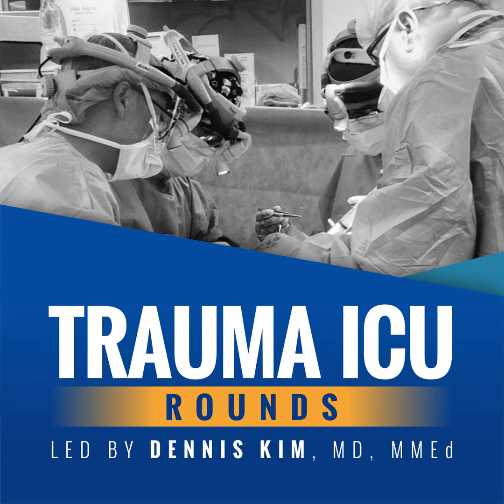So starting from the top and making our way down, from a neurologic status, we want to make sure that patients have a reasonably appropriate mental status. This is not to say that they need a GCS of 15, but ideally patients are somewhat cooperative and able to participate in care, especially when it comes to things like clearing their secretions and participating in physiotherapy.